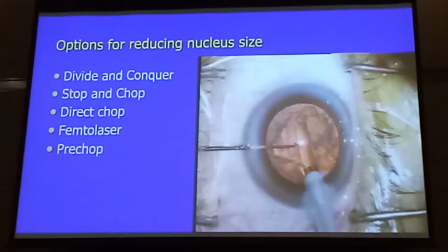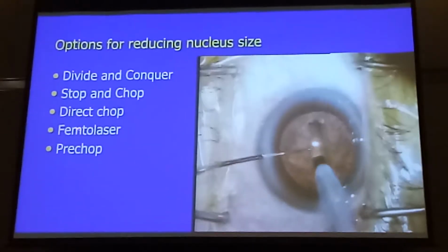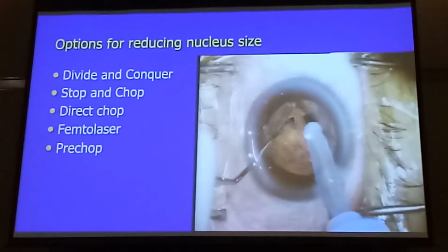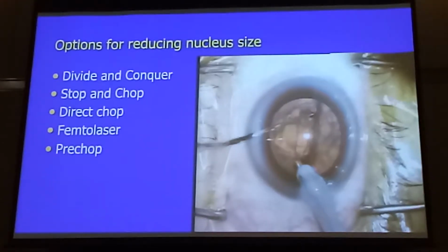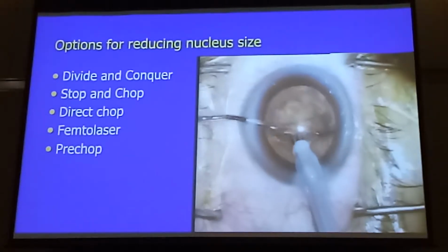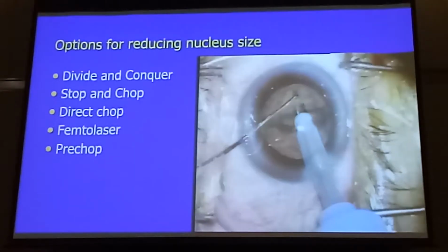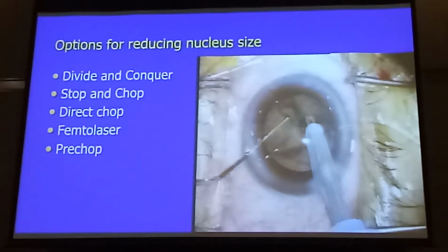And as we heard from Sri, there are many techniques: divide and conquer, stop and chop, direct chop. Professor Chi after me is going to tell you about the rich person's way of doing a pre-chop. Okay? And Professor Chi is a very wealthy surgeon, so she can afford that. I'm a poor surgeon, so I will do the poor man's pre-chop. Okay? So as you can see from there, that's exactly what Sri showed us earlier.